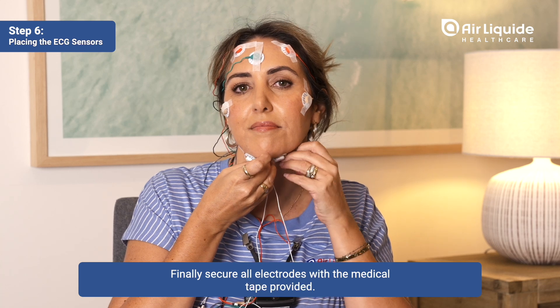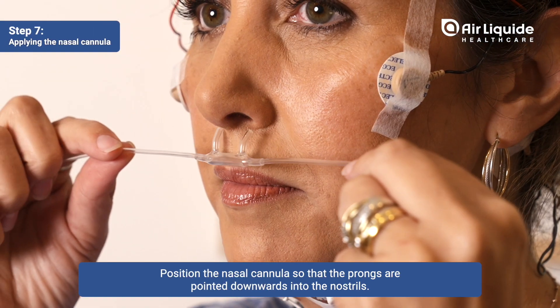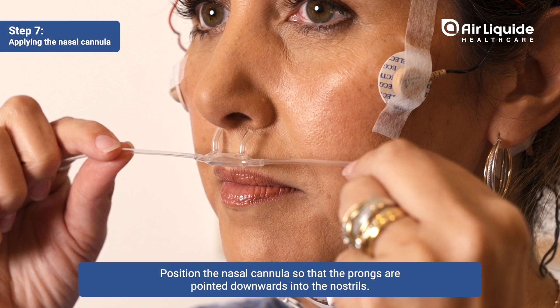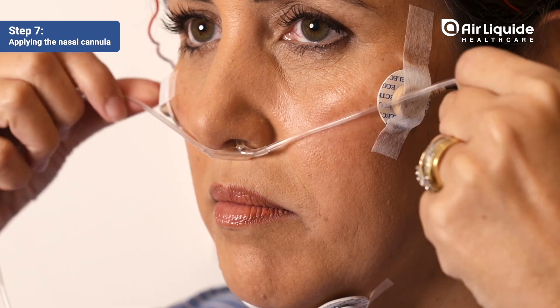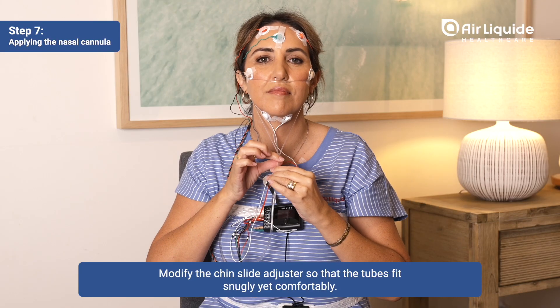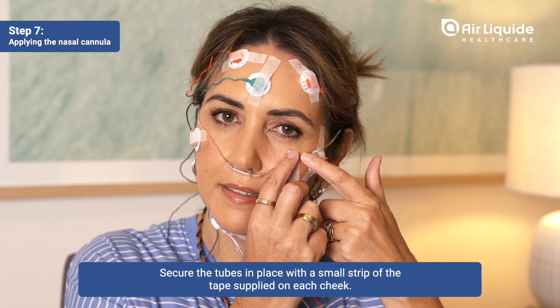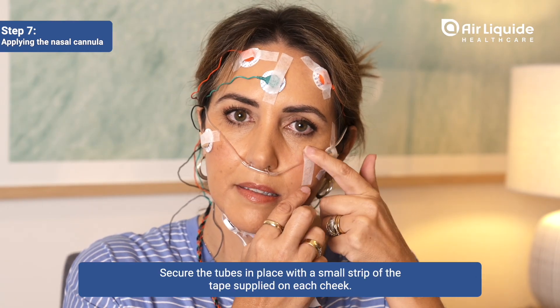Finally, secure all electrodes with the medical tape provided. Position the nasal cannula so that the prongs are pointed downwards into the nostrils. Modify the chin slide adjuster so that the tubes fit snugly yet comfortably. Secure the tubes in place with a small strip of the tape supplied on each cheek.